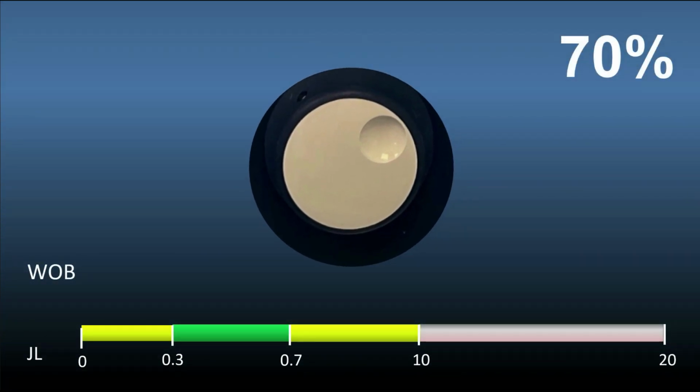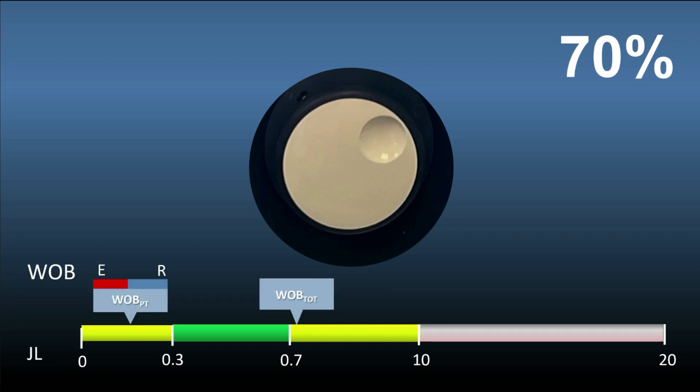The mode has been engaged, and now you need to be patient for a minute or two while the ventilator makes its calculations by doing inspiratory holds, expiratory holds, measuring flow, etc. The patient is breathing away, it's perfectly safe. Think about how long it takes for an oscillometer to measure blood pressure. And after a certain period of time, the work of breathing indicators appear. And this is where you look. Give it a couple of minutes to settle.